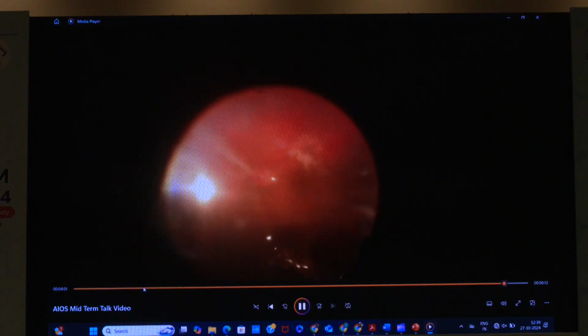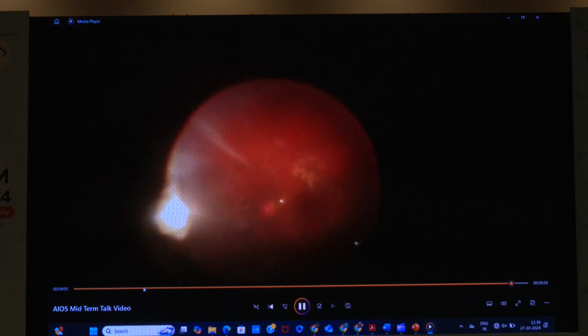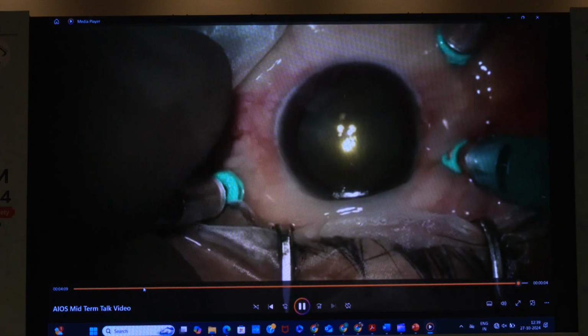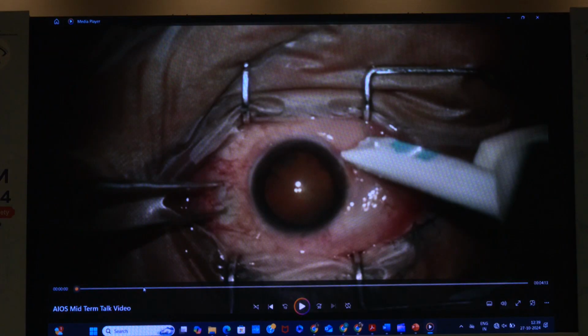Last of all, this silicone oil injection. You see that I am injecting till my globe is 3/4 full. I'll keep visualizing. Once 3/4 filling is over, I will put a vent. Till it comes out of this vent, I will wait. Now it has come out and surgery is over. And you have to remove the last bubble with your flute.